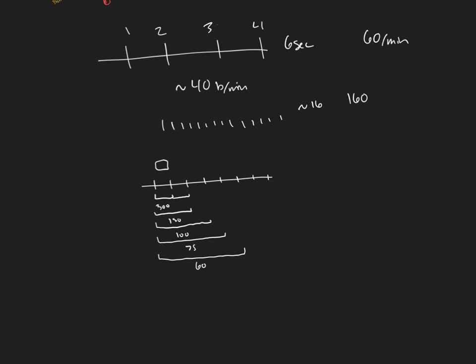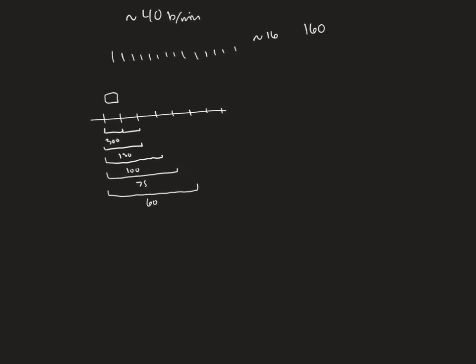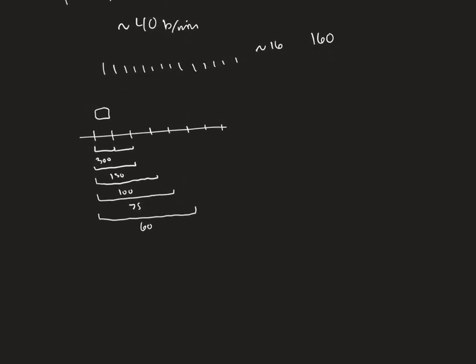And you can just look at the readout on the 12 lead to get a rate. It's one of the only things you can trust it to actually have is a rate, unless it's AFib, and then sometimes the rate is averaged and whatever. But yeah, 300, 150, 100, 75, 60, 50, 40-something. So when you're looking at a 12 lead and it shows QRSs lining up with these boxes, then you can quickly obtain a basic rate. Like, 300, 150, 100, 75, yeah, it's about 70. And then you have a ballpark rate if you're not busy looking up at the metrics at the top of the EKG.